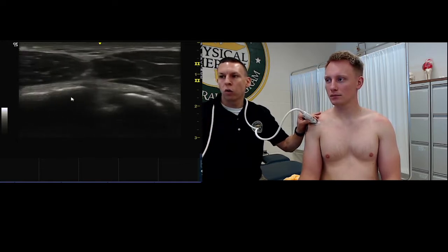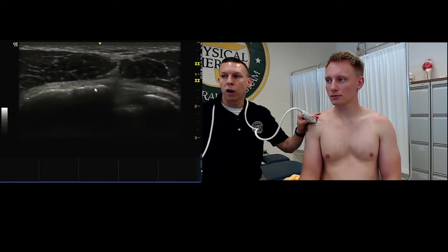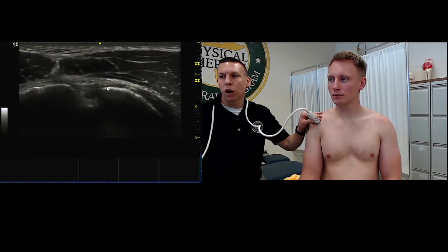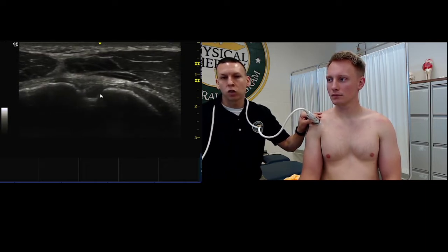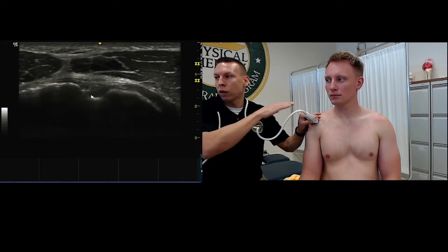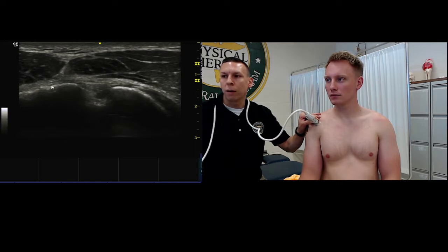So once we know this is lateral, we know that's the greater tuberosity. We're looking for bony acoustic landmarks. So we want to find the greater tuberosity and the lesser tuberosity here, and between those is the bicipital groove. In the shoulder region, I like to call this home base. So that's the first thing you're going to look at. You're going to put the shoulder right in this position, put your probe right down on the front of the shoulder, and look for these bony acoustic landmarks.